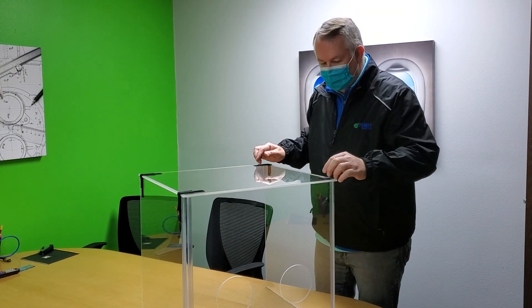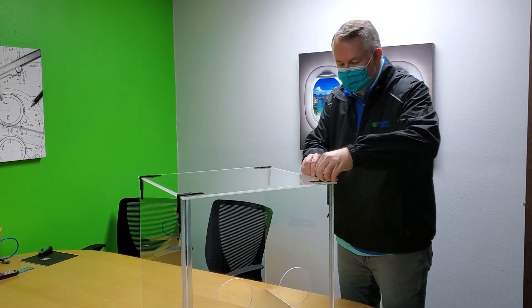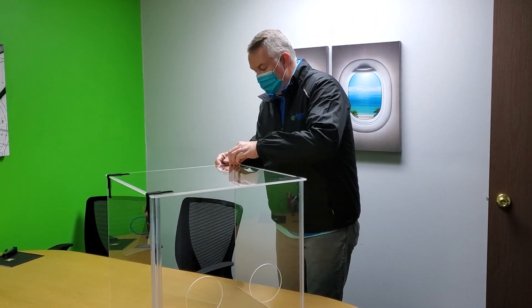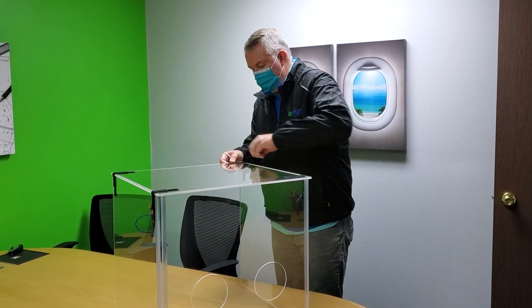It's made out of quarter inch acrylic on four corners. We have Velcro — the soft part of the Velcro is on the outside. We put the harder hook on the material so you can spray it or wipe it off. There's one in this corner.